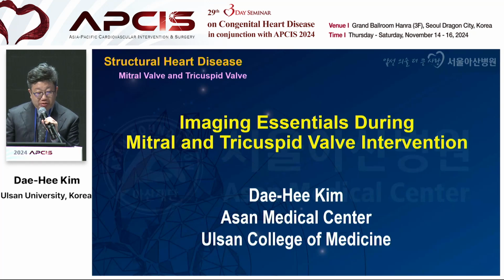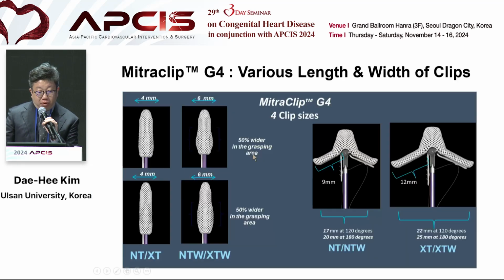The topic I received is imaging essentials during mitral and tricuspid valve intervention. Unfortunately, we don't have any available tricuspid valve intervention device currently, so I have no experience in tricuspid valve intervention. Today, I will talk about mitral valve intervention alone, especially the TEER procedure.